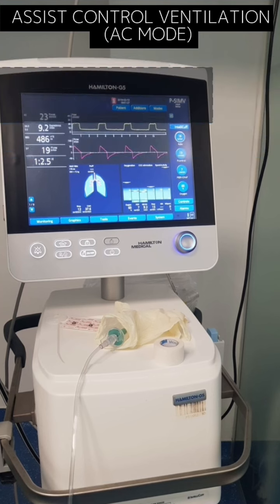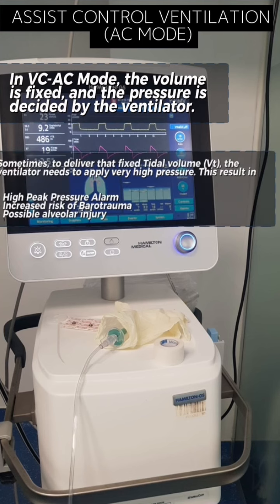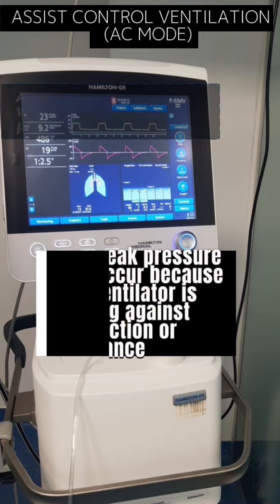In VCAC mode, the volume is fixed and the pressure is decided by the ventilator. Sometimes to deliver that fixed tidal volume, the ventilator needs to apply very high pressure. This results in a high peak pressure alarm. If the alarm rings, it indicates increased risk of barotrauma and possible alveolar injury. The ventilator essentially warns you: you set a constant volume, I'm trying to deliver it, but I am being forced to generate too much pressure to push this volume into the lungs. So what should you do if you see a high peak pressure alarm?